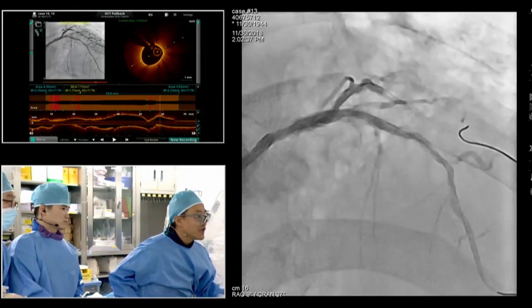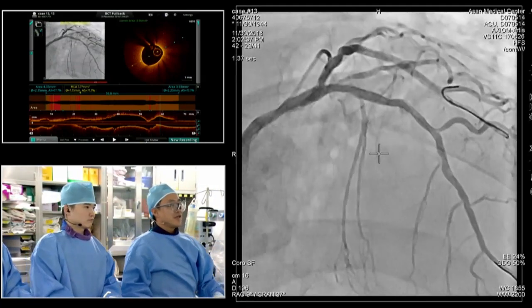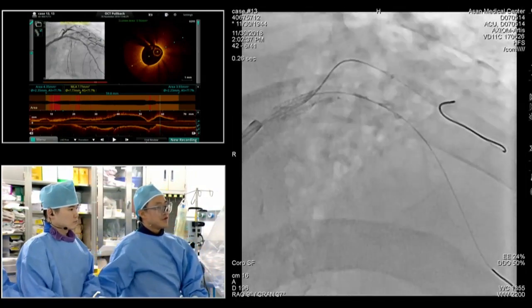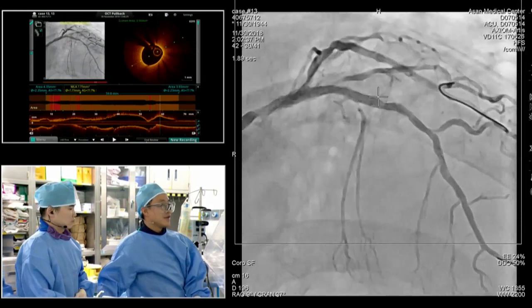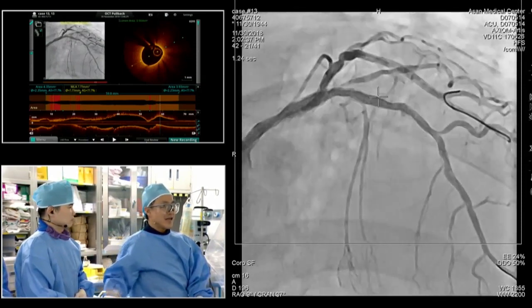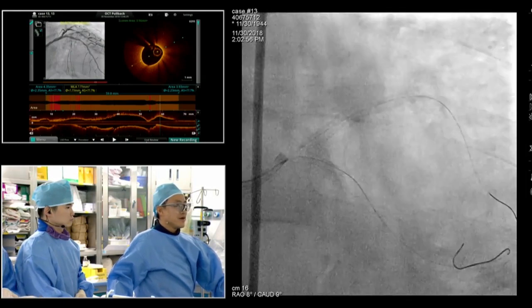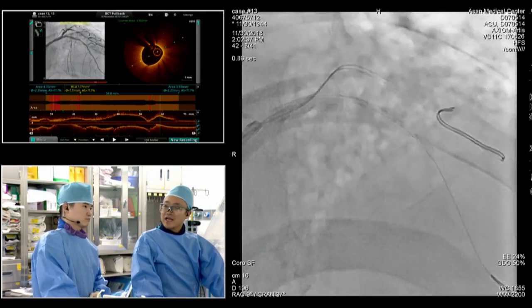So this stent has been treated with DEB as well? Not yet. I thought it was in the history that it was treated with something a year later. Not a year. So definitely 9 years ago. So it's been treated with DES and DEB. 10 years ago DES, 8 years ago DEB. Do you know how long the DEB was? Was it treated the whole stent or just the focal proximal area? I don't have enough data.